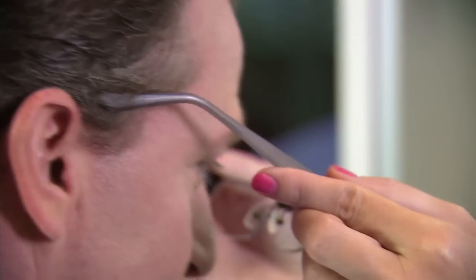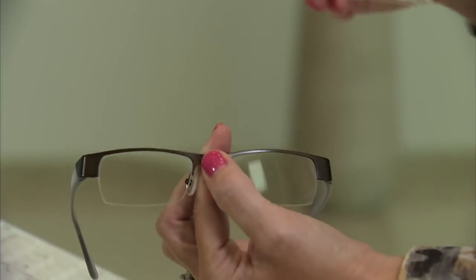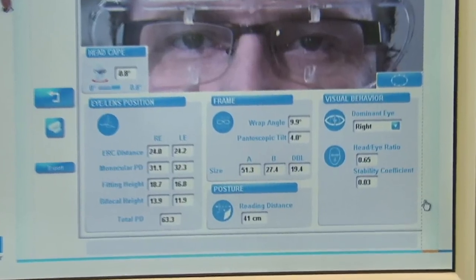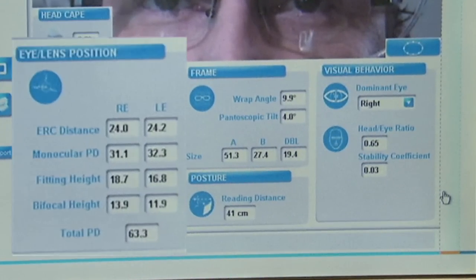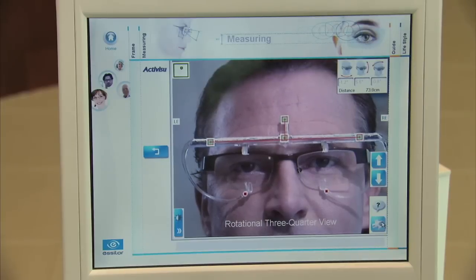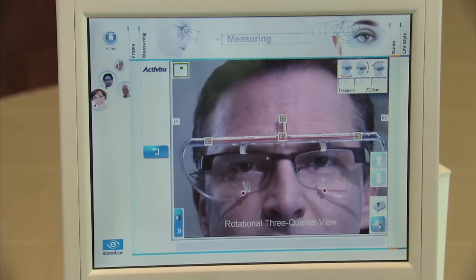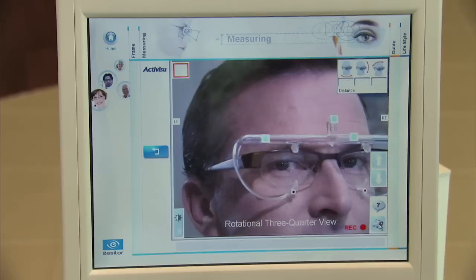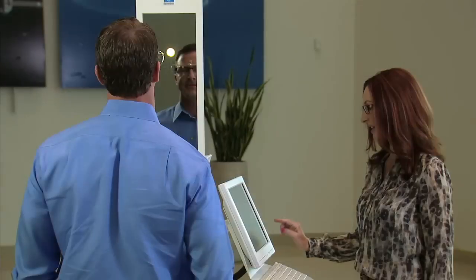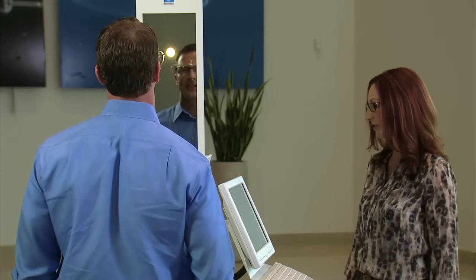Before measuring, a special clip with sensors is attached to a pre-adjusted frame and given to the patient to put on as he or she would wear the frame normally. The two-picture measurement results in all parameters the ECP will need, from frame measurements to fitting height and monocular pupillary distances, to natural head posture and the eye rotation center. The VisiOffice system takes two pictures: a straight-ahead shot, and one in which the patient turns his or her head 20 degrees to the side while continuing to focus the eyes on the mirror. The entire two-picture process takes less than one minute.